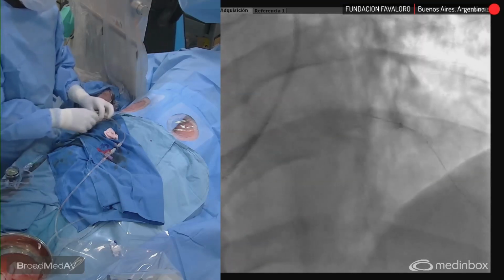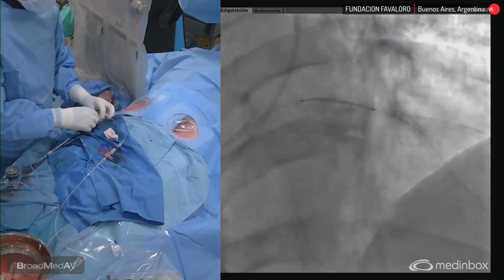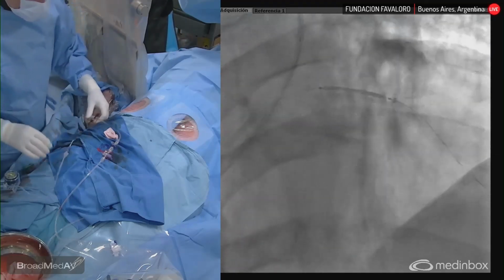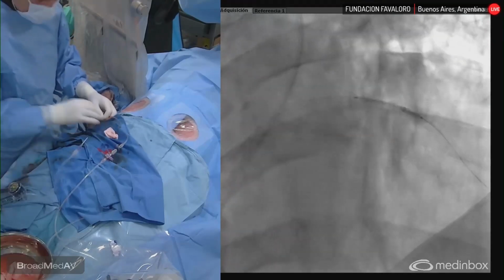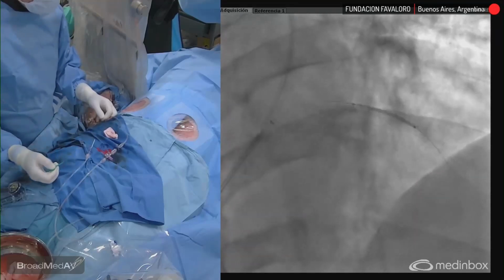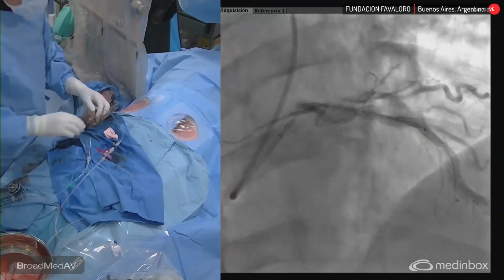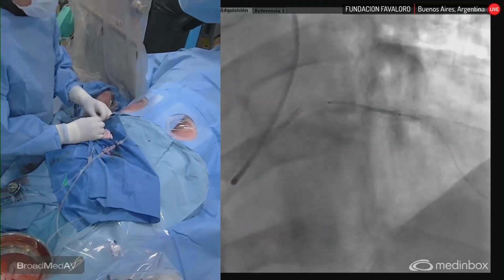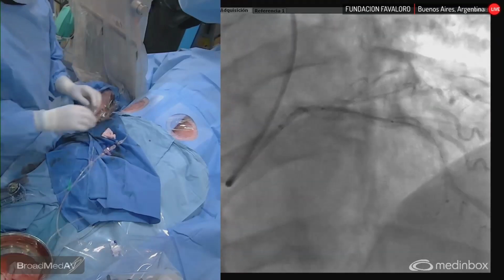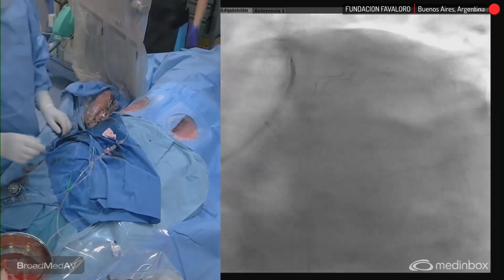Something that we are not doing here, but because I felt that it advanced very smoothly, is to check when the stent is entering into the proximal part of the guide extension. So I will leave the stent distally, sorry. I will pull the device. I will do a test to be sure which is going to be the position for deployment. So we are quite far away. Have to go back, test. And now we can go to spider view. We have a lot of small branches. Then we will decide which one we should rescue.